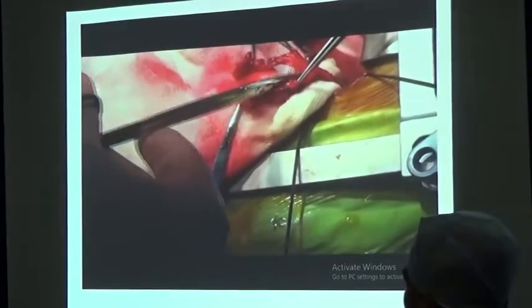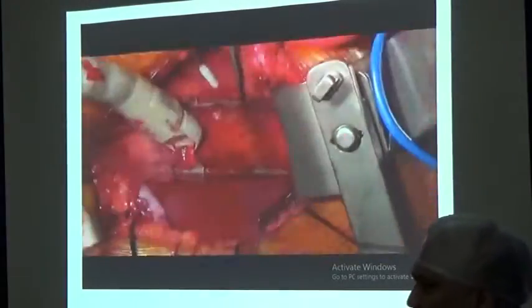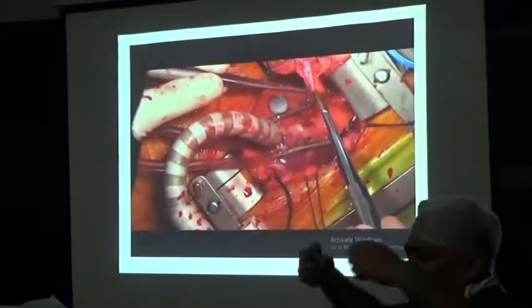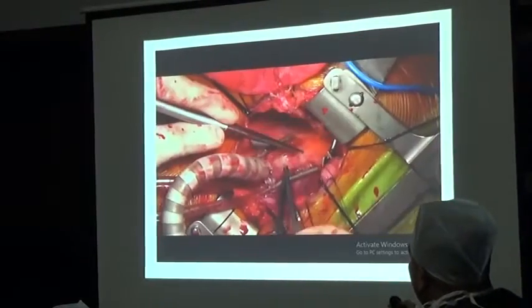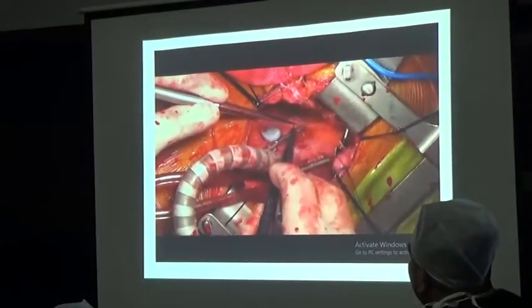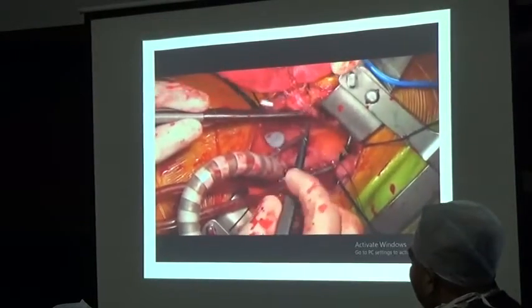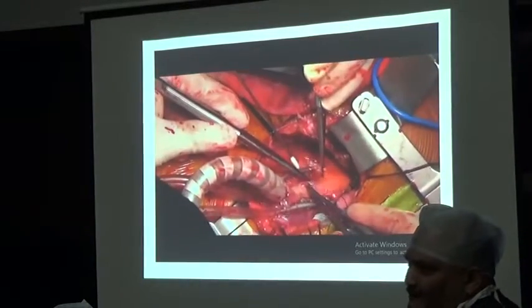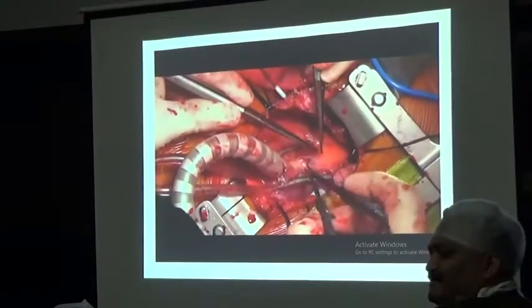Then you have to lift that heart, push the heart into the incision cavity. You have to take pericardial stitches and lift it, you can say like marsupialization. So lift the heart with the pericardial stay. You can see a lot of stay sutures. And then routine, the way we do CABG, the same way. In fact, I was more comfortable doing the anastomosis compared to the traditional CABG in the anterior vessel and a diagonal.